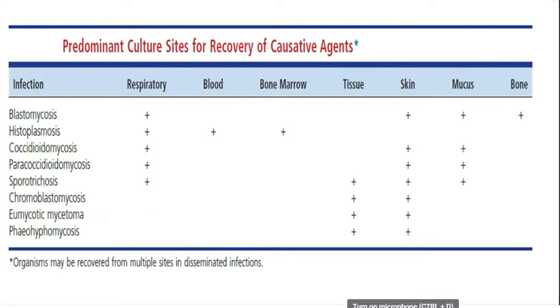Now, this was lifted up. So, you can see kung anong mga specimen ang best na re-recover natin yung fungi na nagkukos ng infection. And this is also in your module. Since everyone has said they have the module, you can just go over and review it too.